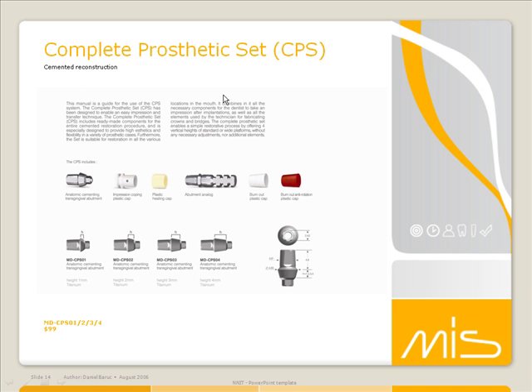The next thing is the plastic impression coping, which has a flat side. There's a flat side on this abutment as well, which you want to place buccal. You then take that plastic cap, place it on this abutment, make sure the flat sides match up, make sure the margins are even at the bottom, and take your impression.